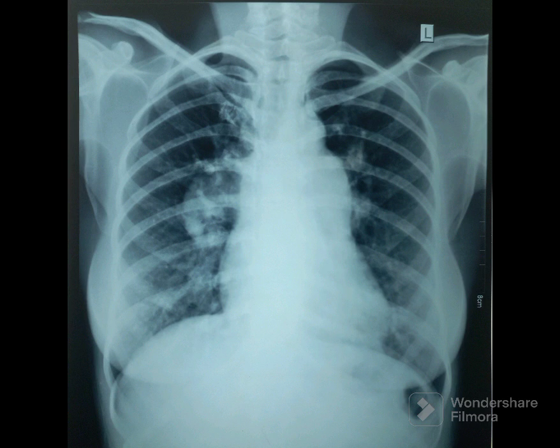Two significant findings should be noted in this chest X-ray. Focus on the right side of the hilum — you may see an opacity with a broad base from the hilum and tapering forward. This is the right pulmonary artery, and it is visibly enlarged. The left pulmonary artery is not distinctly visible because it is superimposed on other cardiac and vascular shadows.